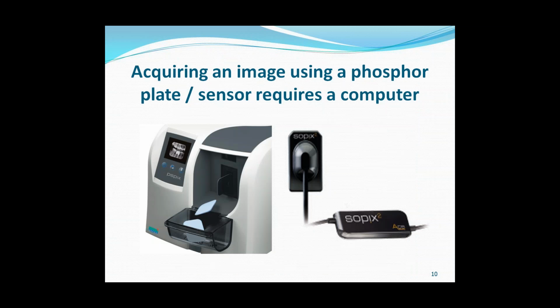So when you start taking a large number of radiographs, so I guess my definition of a large number would be 3 or 4 patients on a day, and you might be taking 4 or 5 radiographs on each of those patients. So you might be taking, say, 20 radiographs. What you'll find is that the time really sets you back and really slows you down, and you'll want a faster way of developing your films. And also, if you're taking that many pictures, in theory you should be able to afford a more expensive machine.